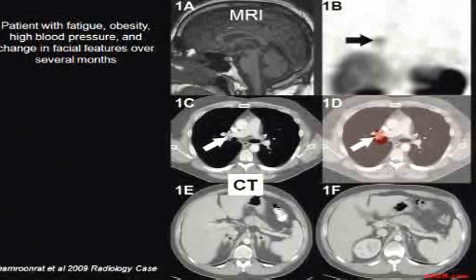In this particular person, the adrenal glands are also enlarged, actually about 4 times enlarged on both sides. So now we have an interesting picture. We have somebody who presented these symptoms. It looks like they're Cushingoid. They have some kind of syndrome where increased hormone production is occurring. That was confirmed by a blood test.